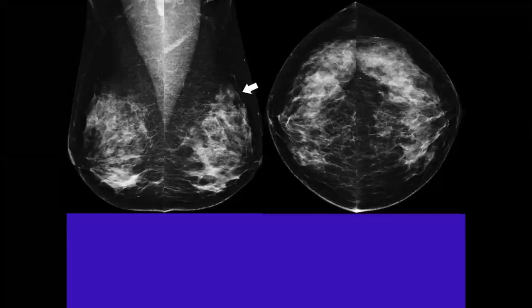Could you appreciate it in the other view? No, you could not appreciate it. So, what do you think? It's an area of focal asymmetry. So the next step could be a spot magnification view for this area. Excellent. So I could not see it here, but it might not be included, because I don't know if the posterior nipple line is within 1 centimeter or lower or not.